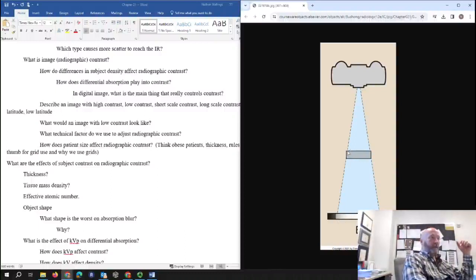Because this area is higher and further away from the image receptor, we're going to have a loss of sharpness for recorded detail, but at the same time, because we've got to penetrate that, we're going to go from dark to slightly less dark to clear. Then it's going to give us the appearance of a loss of contrast as well. So we've got more gray. We have a longer grayscale. That's what we refer to as absorption blur.